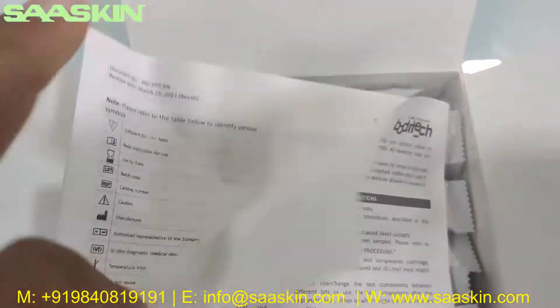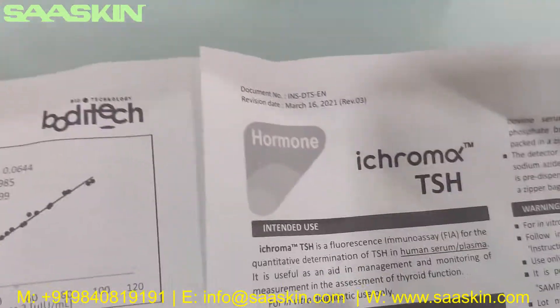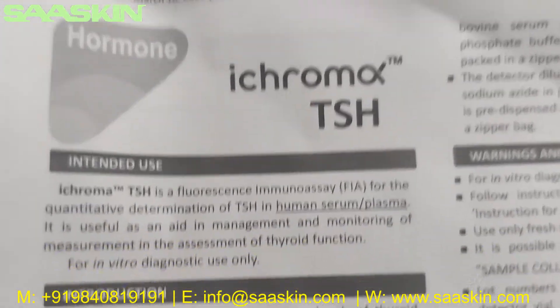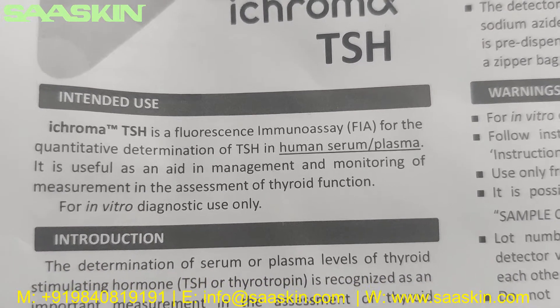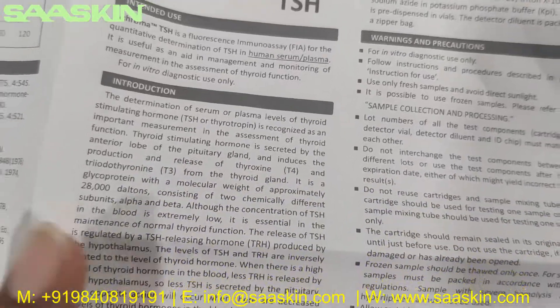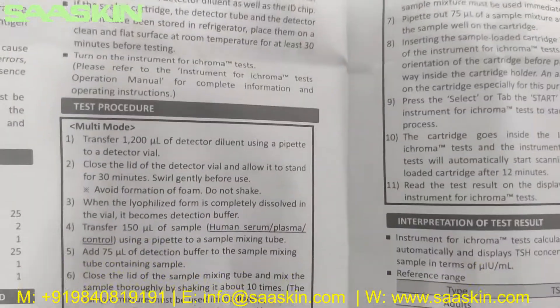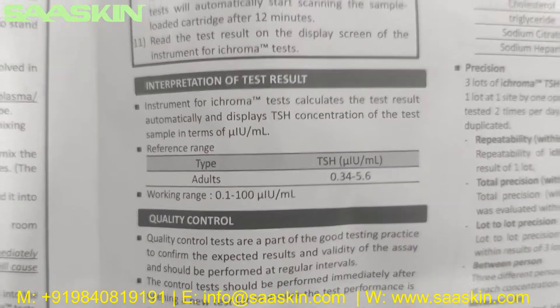You will also get one package insert. This is the instructions-for-use brochure. It is for the iChroma TSH — a fluorescence immunoassay for the quantitative determination of TSH in human serum and plasma. This brochure contains the complete instruction manual, testing procedures, warnings, limitations, test setup, and how to interpret your results.